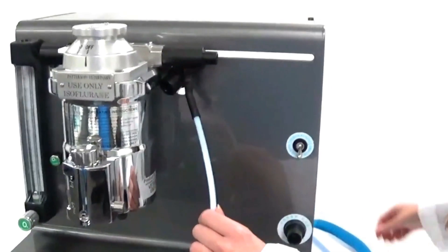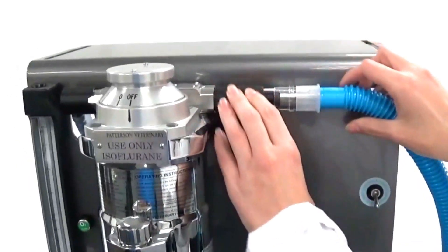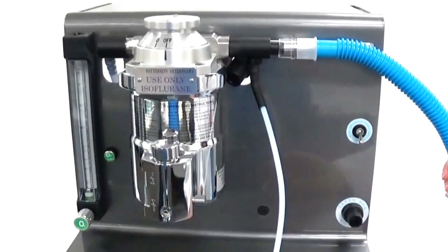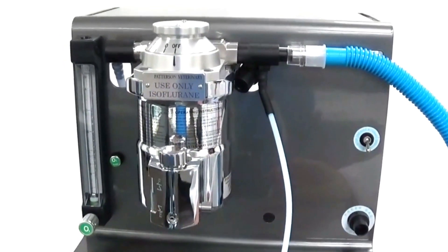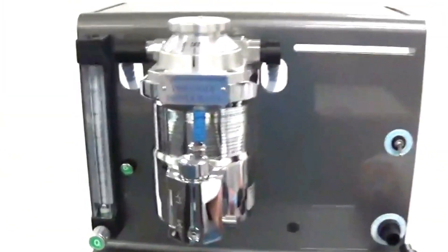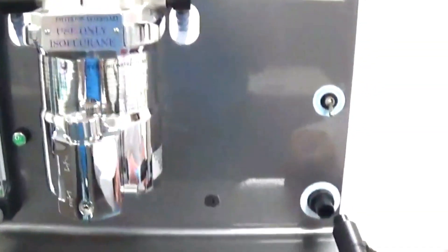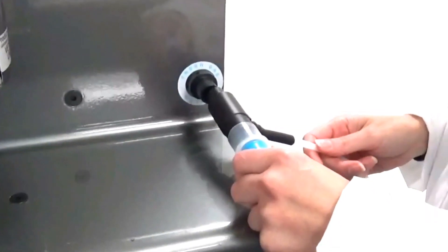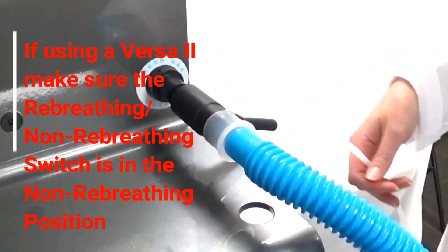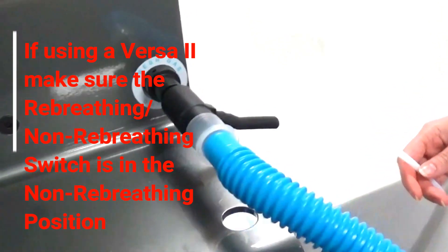Then we will attach the 19-millimeter tube to the 15-millimeter side of the gas sampling tee, as shown. If it is difficult to get to the outlet side of the vaporizer to remove the end cap, another option is to connect to the fresh gas outlet using the 15-millimeter tapered side of the gas sampling tee, and attach it as shown.